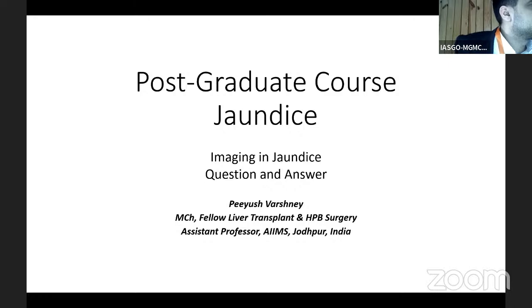And the other aspect is the PTC. Regarding the PTC, I think it was an excellent lecture by Dr. Heera Ram. But like in the context of ERCP, we should understand that PTC is also not an evaluation tool. It is mainly a therapeutic tool. When you go in for an intervention, you can use the PTC simultaneously to get some diagnostic information, but it's not a standalone diagnostic tool.